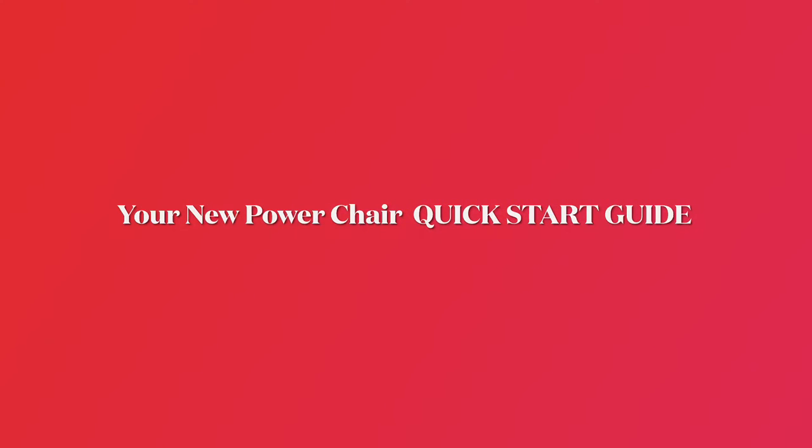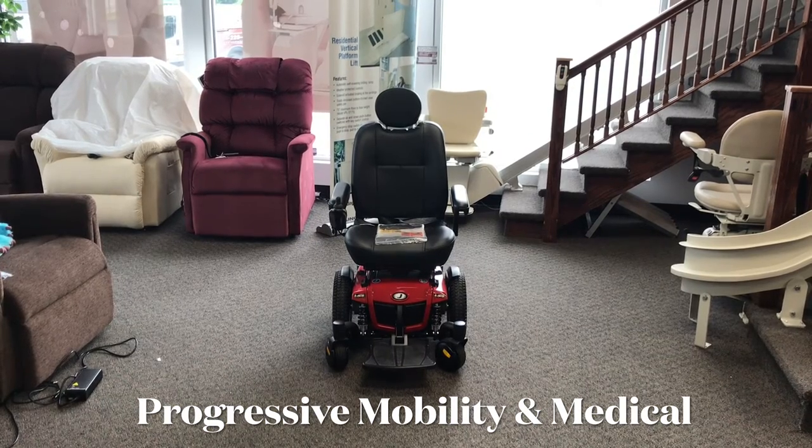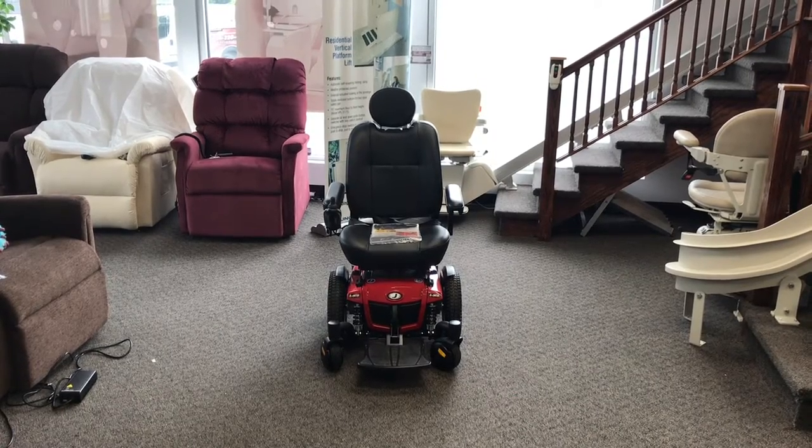Hi, this is Carson with Progressive Mobility and Medical, and this is your New Power Wheelchair Quick Start Guide. Anytime anybody gets a new power wheelchair, especially if it's your very first power chair, I recommend you read the owner's manual. I know that may seem boring, but everything that I say is in the owner's manual.